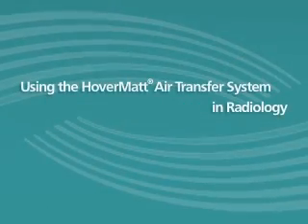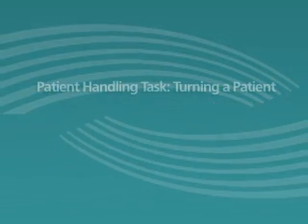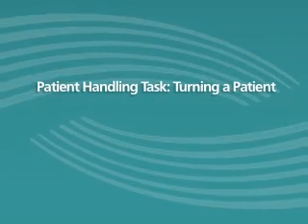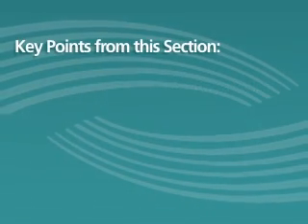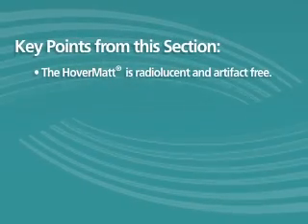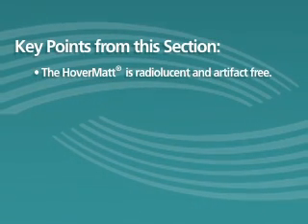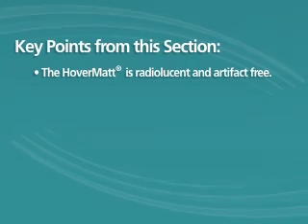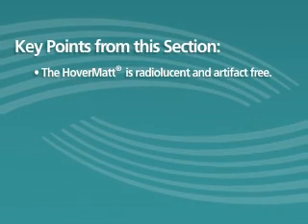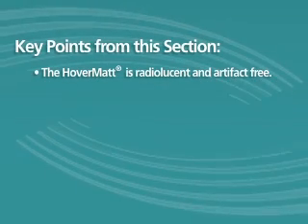In this segment, we explained how to use the HoverMatt in the Radiology Department. We taught one HoverMatt patient handling task: turning a patient. Here are the key points from this section. The HoverMatt air transfer system can be used in radiology to make transferring and repositioning the patient easier and more efficient. Because it is radiolucent and artifact-free, the HoverMatt transfer mattress can be left beneath the patient during the X-ray.